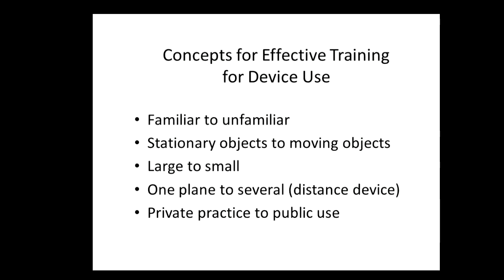And then starting in private, helping the student to build their skill, to become more comfortable, and then gradually finding the setting and letting the student identify the setting where they can be using the device in front of people. So they're getting familiar with that power of the telescope, and it is only through stretching that power and testing how far away can an item be?